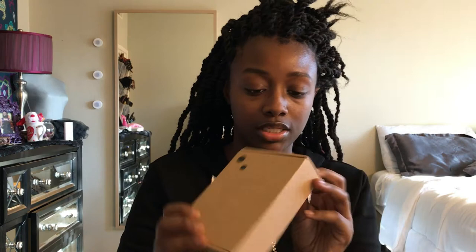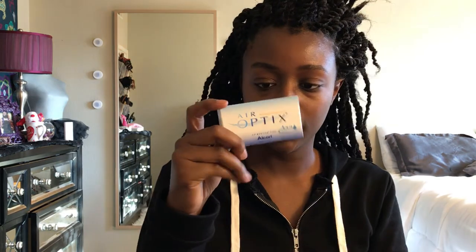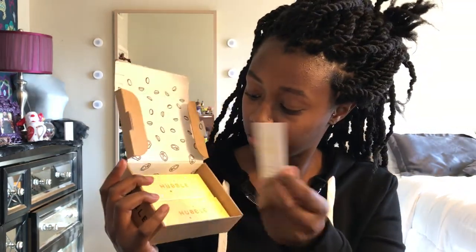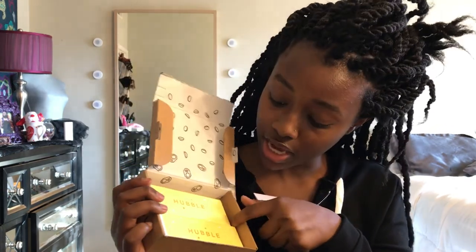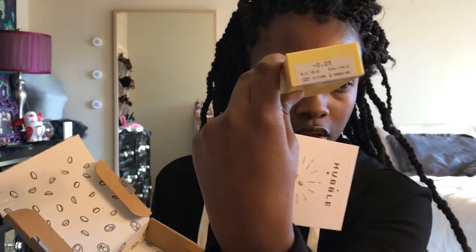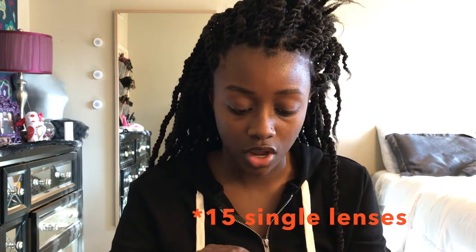It's just this little box and it says Hubble right here. I usually use Air Optics contacts. It's really cute — on the inside it looks like a little booklet, and here are the two boxes of contacts. Each box has 15 pairs of contacts in it and it shows my prescription.